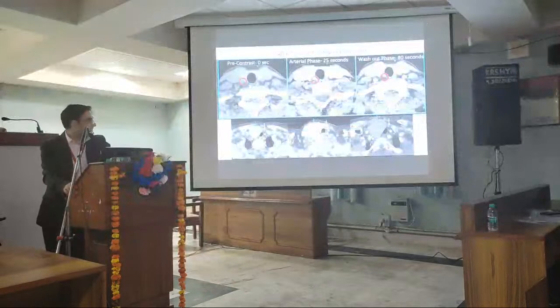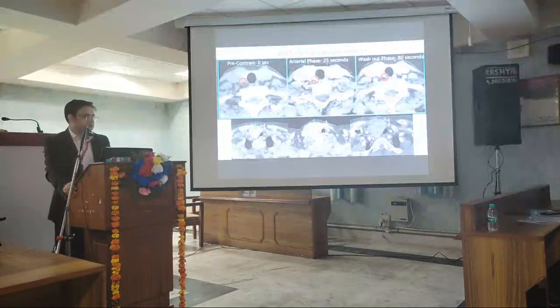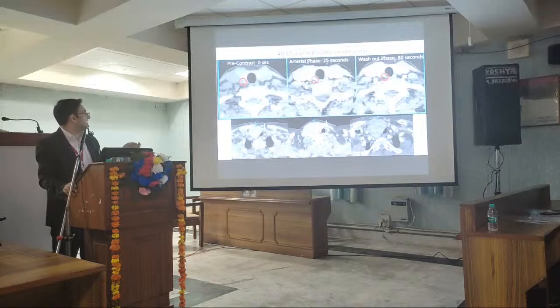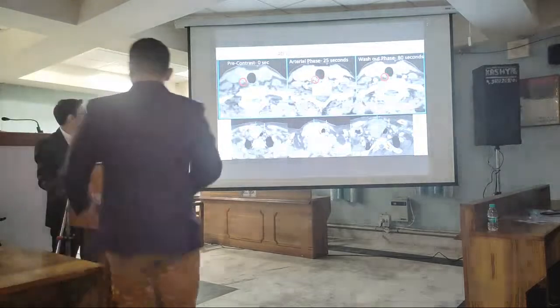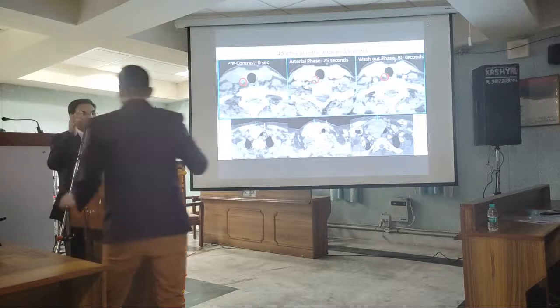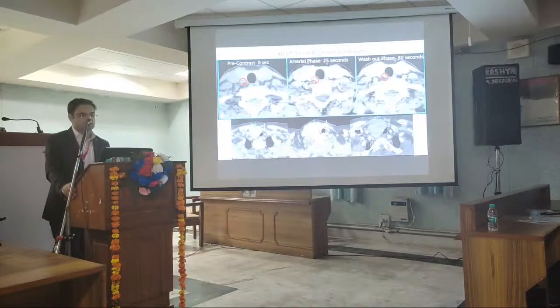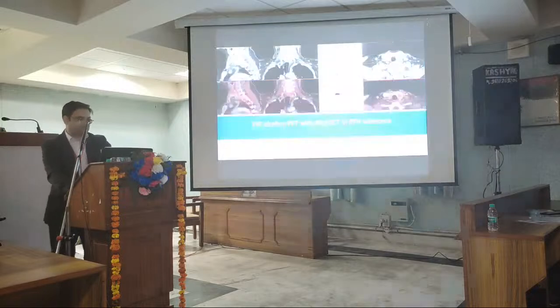Another additional investigation we can do is the 4D CT scan in the case of parathyroid adenoma. Typically, a parathyroid adenoma is hypodense compared to the adjacent thyroid tissue. We give contrast across the arterial phase, and they brighten and become approximately homogeneous, and then there is washout in the delayed phase. This technique helps in localization, especially in patients with multinodular goiter or multiple small parathyroid adenomas of approximately 2 to 4 mm.